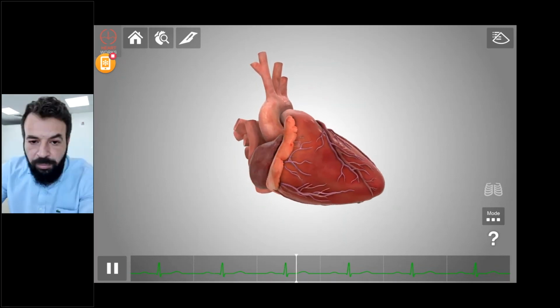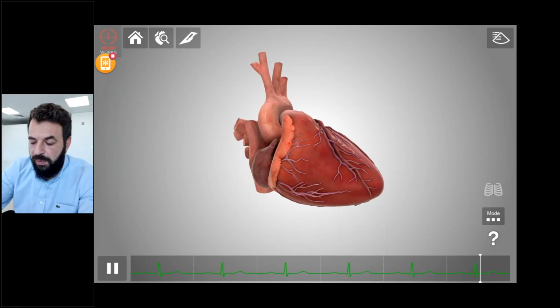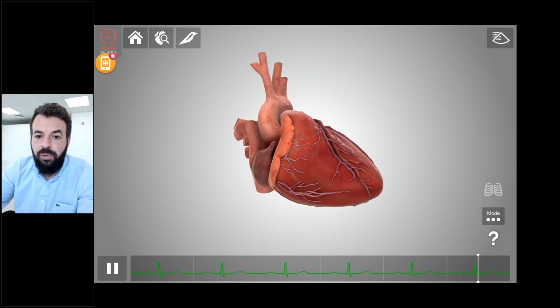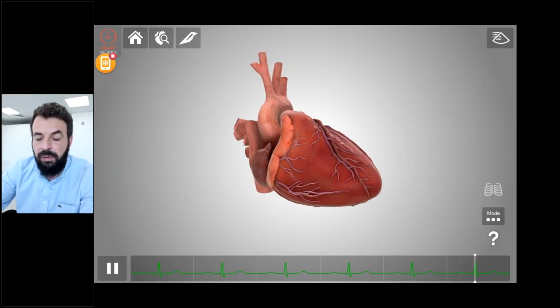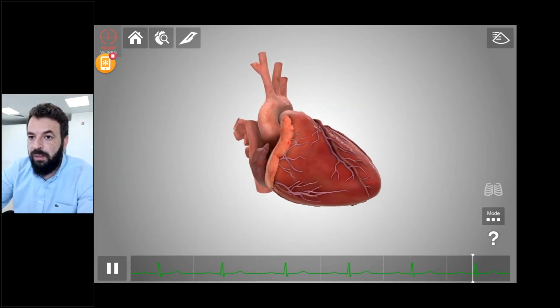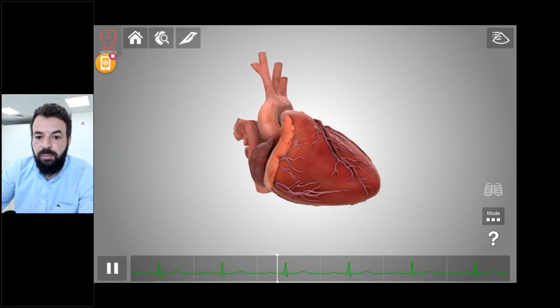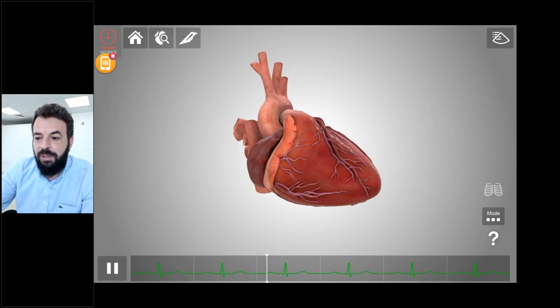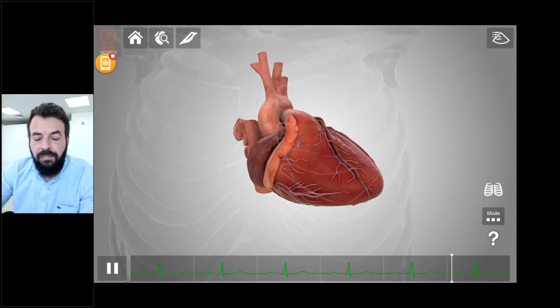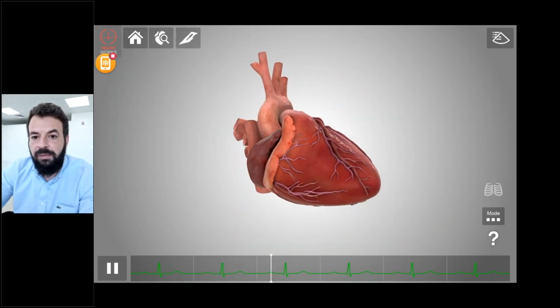Yes, exactly. Thank you. And I wanted to mention that as well. Heartworks is basically an ultrasound simulator that has the TTE and TEE and even POCUS ultrasound teaching. It is the highest in fidelity now in the market, and we are preparing for another webinar to show the Heartworks, the full ultrasound simulator with all its capabilities. So this is a webinar to come. We're gonna be announcing it very soon. Any other questions?